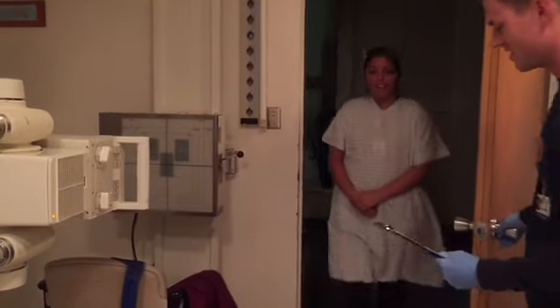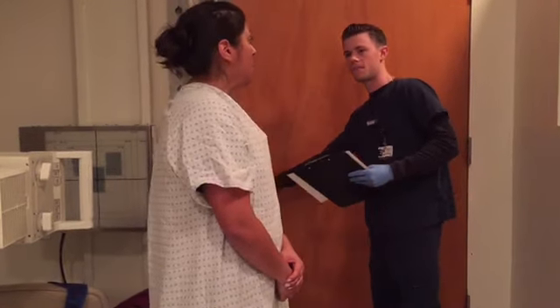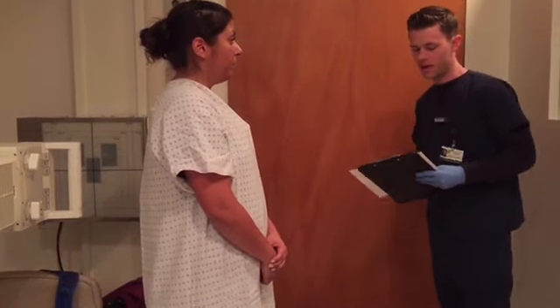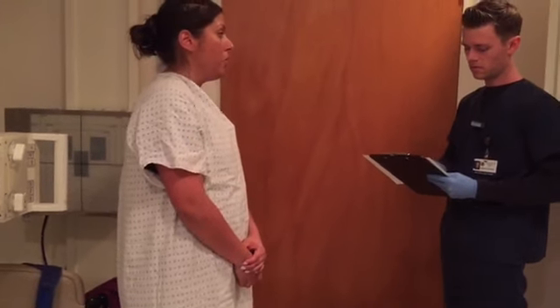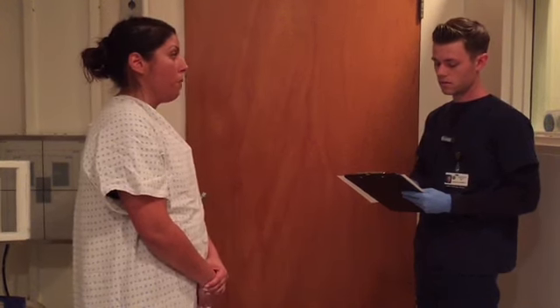Hello. Hi. Is this Evelyn? Yes. Hi, can you confirm your last name and your date of birth for me? Yeah, Malero, August 19th, 1987. Okay, perfect. My name is Cameron. I'm going to be doing some x-rays today. Can you tell me what brings you into the hospital? Yeah, I've been experiencing some sinus pressure. Also, I had an accident, fell and hit my face, and so my jaw is bothering me now.